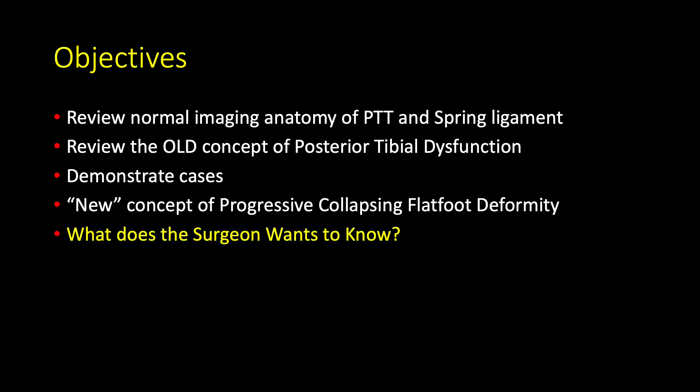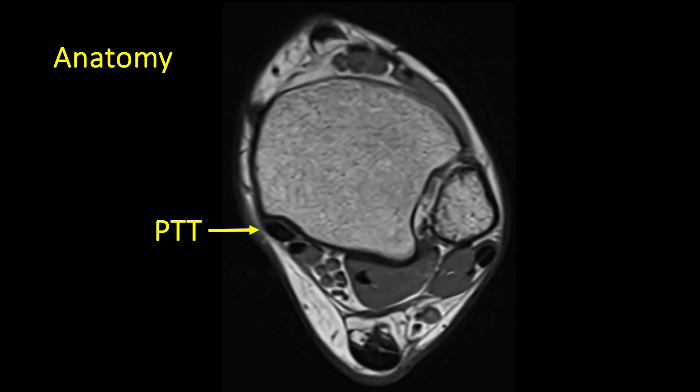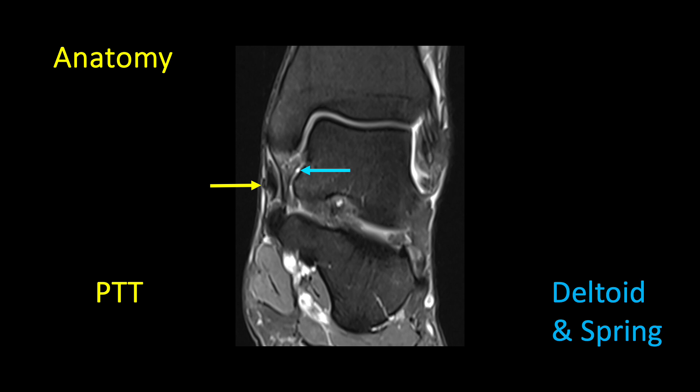Finally, I'm going to focus on what it is the surgeon wants to know. A basic review of the anatomy, first in the axial plane, from medial to lateral in the flexor compartment, we see the posterior tibial tendon, the adjacent flexor digitorum longus tendon, the tibial neurovascular bundle, and the flexor hallucis longus tendon. Now I'll be scrolling anteriorly in the coronal plane, highlighting the posterior tibialis in yellow and the deltoid and spring ligament in blue.